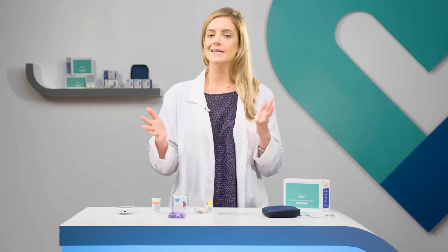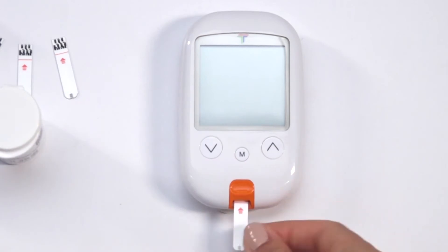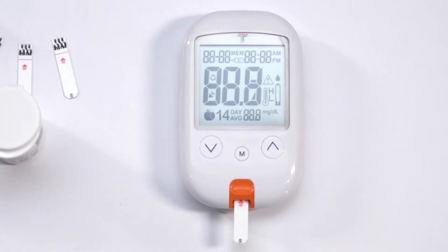To perform this test, you must first make sure the solution is at room temperature, between 59 and 95 degrees Fahrenheit. Insert a test strip, topside up, contact bar end first into the test port.